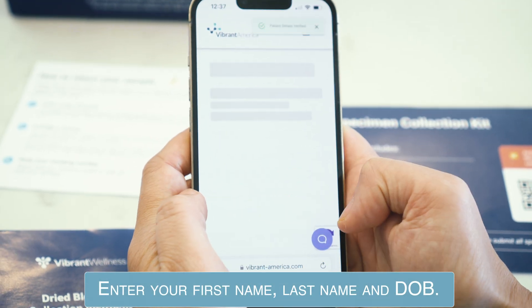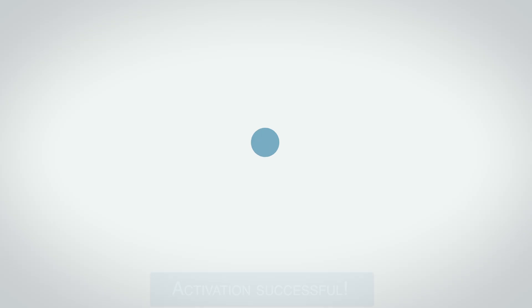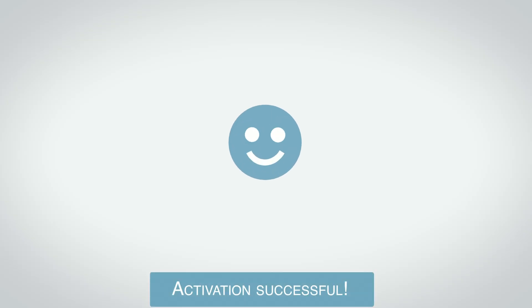Enter your first name, last name, and date of birth. Your kit is now activated. You can now begin the collection process.